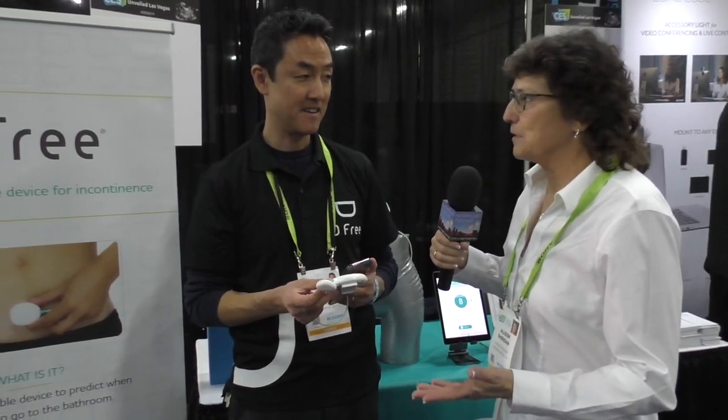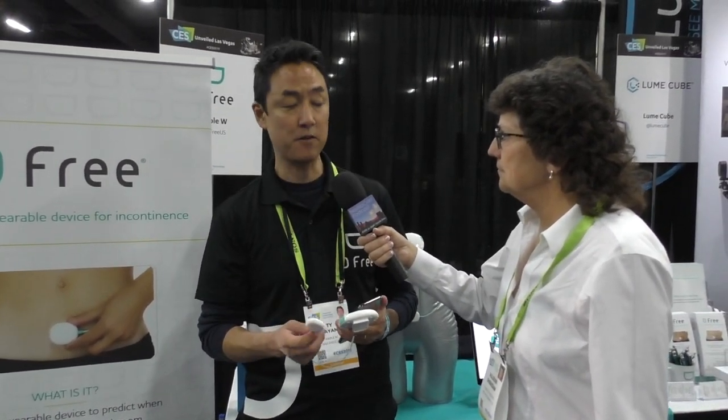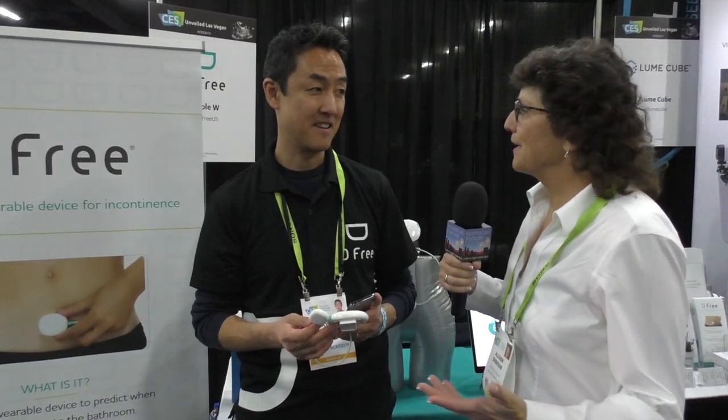It's a portable bladder scanner designed for seniors and people with disabilities who suffer from incontinence. You don't even have to have a disability to be incontinent — you had a baby, whatever it is, it can happen. There are over 500 million people worldwide who suffer from incontinence, so it's a big issue, but no one wants to talk about it.